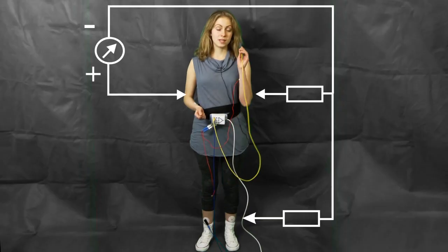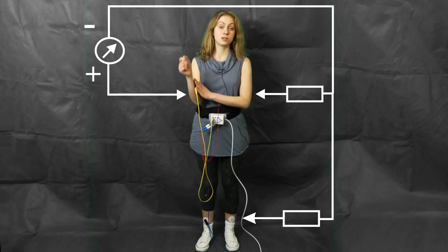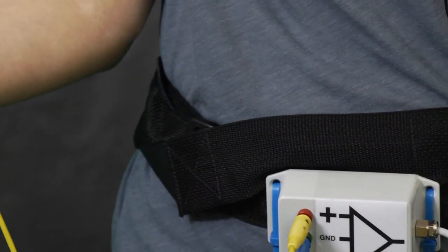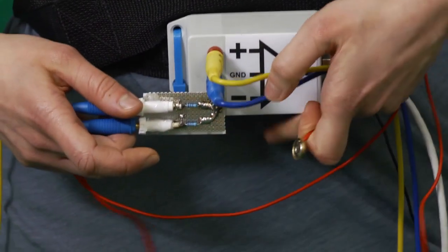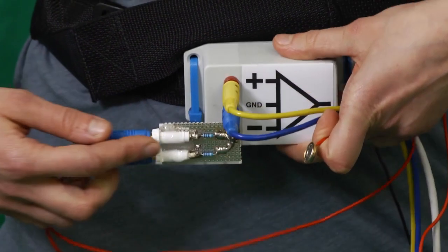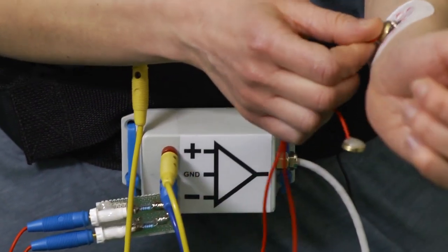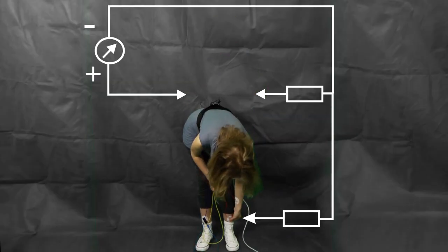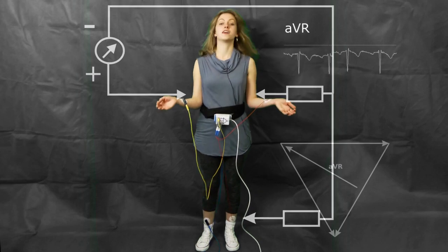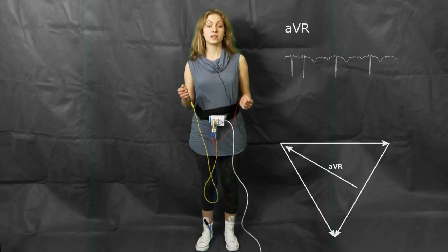Firstly, aVR. We take the positive electrode and connect this one to the right arm, and then the negative electrode, which is connected to our two resistors, is connected one to the left arm and the other one to the left foot. There, this is aVR. Let's move on to aVL.